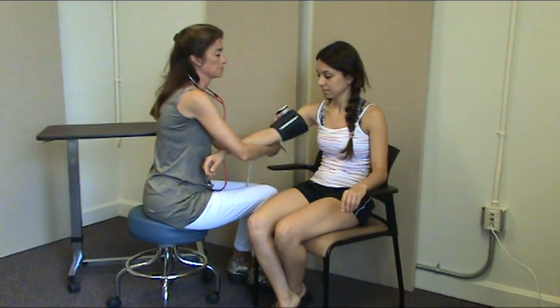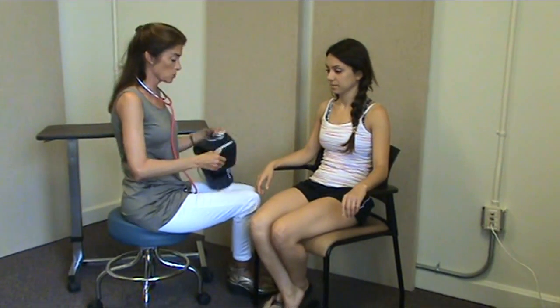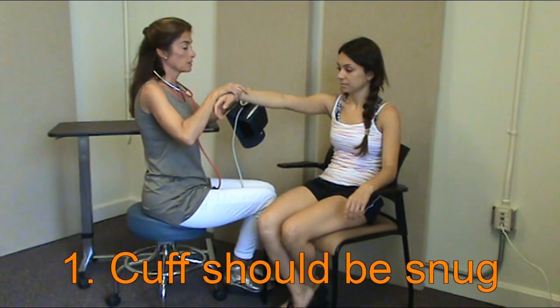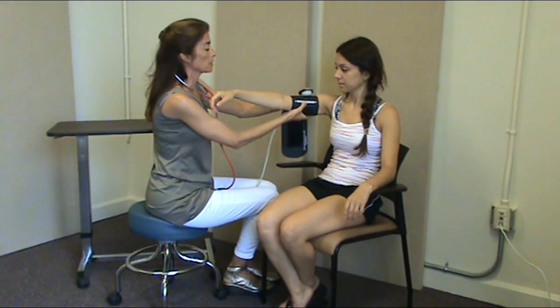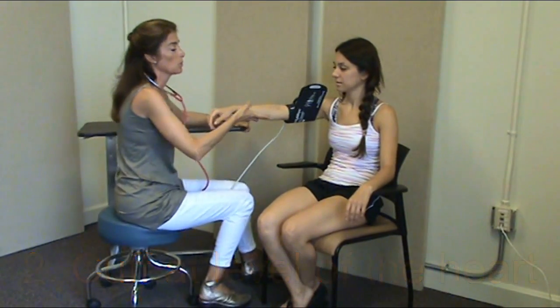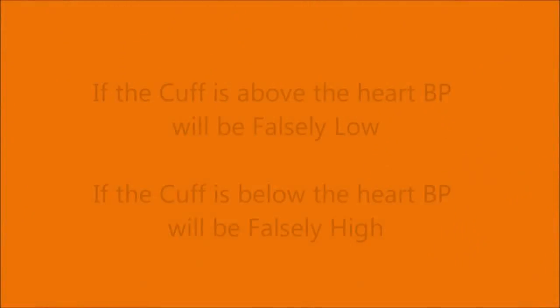and then remove it. So the key things to remember when taking a blood pressure is make sure that you have your cuff on correctly and snug around the arm. You can ask the patient to hold their arm out while you fit the cuff around the arm. You either rest it on a table at the level of the heart, or you hold it in your arm where they're completely relaxed.